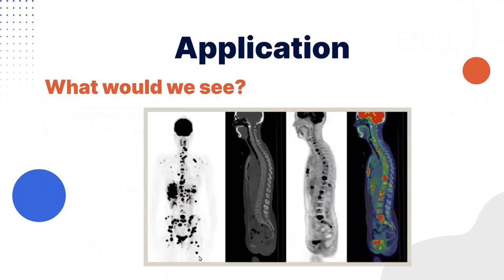For medicine, nuclear medicine imaging can show metabolic hotspots throughout the body and in either hard or soft tissues. This would allow medical doctors to find any areas of abnormal cell metabolism, including tumorous growth or systemic autoimmune activity, such as rheumatoid arthritis.